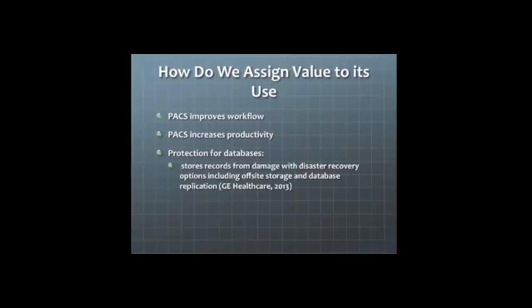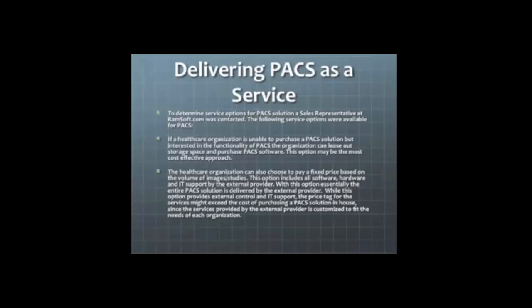There are many ways we can assign value to PACS. PACS improves workflow among healthcare professionals by providing vital information for professionals to share data and consult with one another on patients' care to make more accurate treatment suggestions. PACS increases productivity within departments with mobile access to images and reports on electronic devices such as Apple or Android. There is also protection for databases, which store records from damage with disaster recovery options, including off-site storage and database replication.